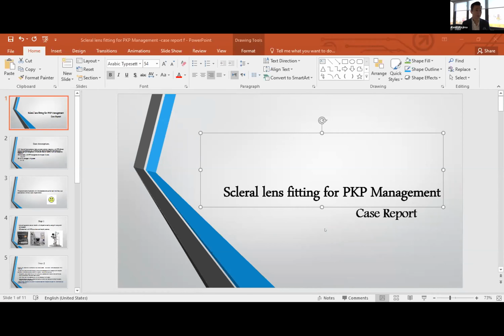Another concern would be IOP, the intraocular pressure. When you put a lens on with that fluid layer behind it, the fluid layer has a suction force, and that suction force appears to raise IOP. So is that a worry over time? We really haven't seen any issues after 20 years of the modern scleral lens, but that would be one that we might keep our eye on long term. But oddly enough, not the tear exchange, which is interesting.